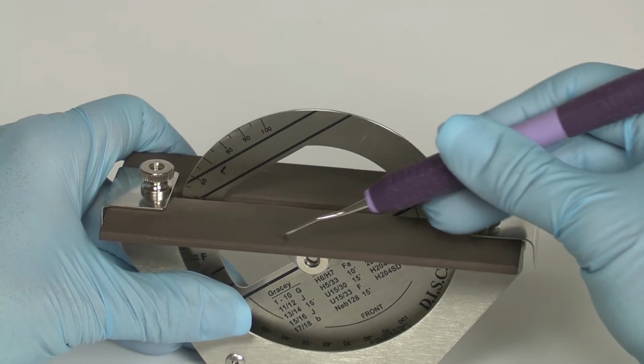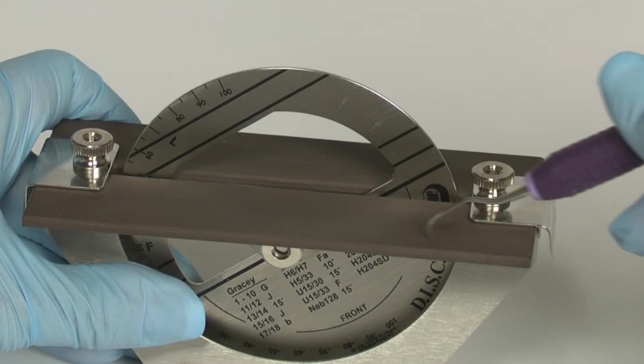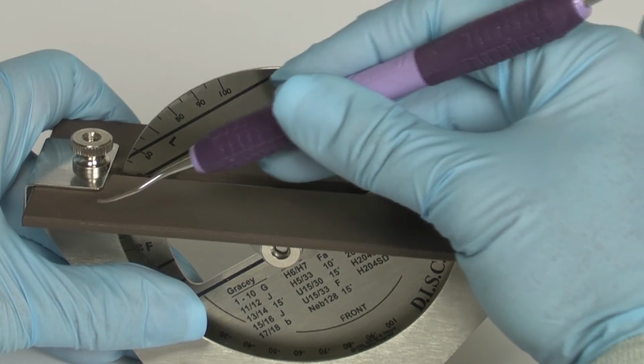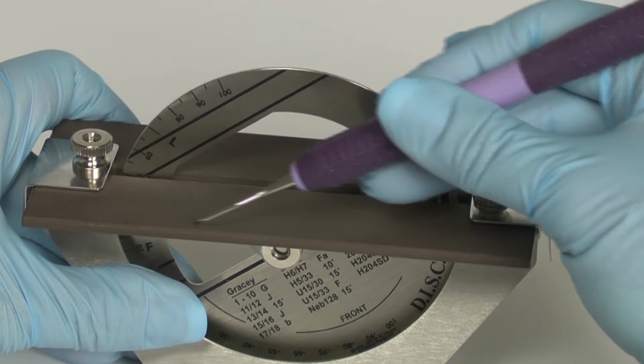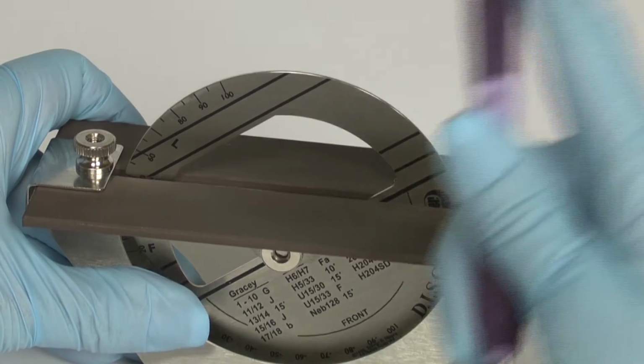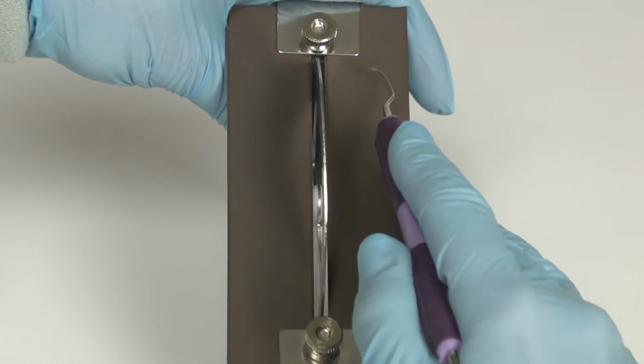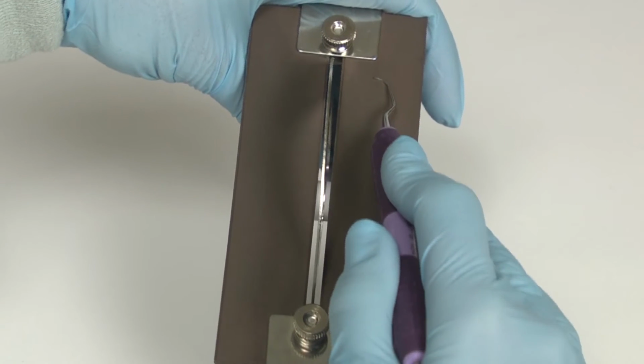The final step requires the operator to roll the handle in a gentle grasp so that the curette is finished in a smooth rounding of the toe. To sharpen the opposite working end, flip the instrument and position the cutting edge on the back stone and repeat the same sharpening steps.